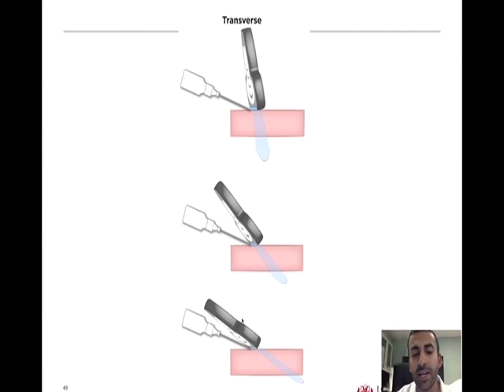For example, down here, having the ultrasound plane in this fashion when the needle is not in the skin would be inappropriate because we're no longer in the ultrasound plane and therefore we would not see our needle. But as this needle is going further in, we would be in the appropriate angle to capture that needle tip, and always appreciating the ultrasound plane coming from the probe and trying to adjust the two so that you're able to match and visualize the structures or procedure needle, for example, of interest is the key thing.